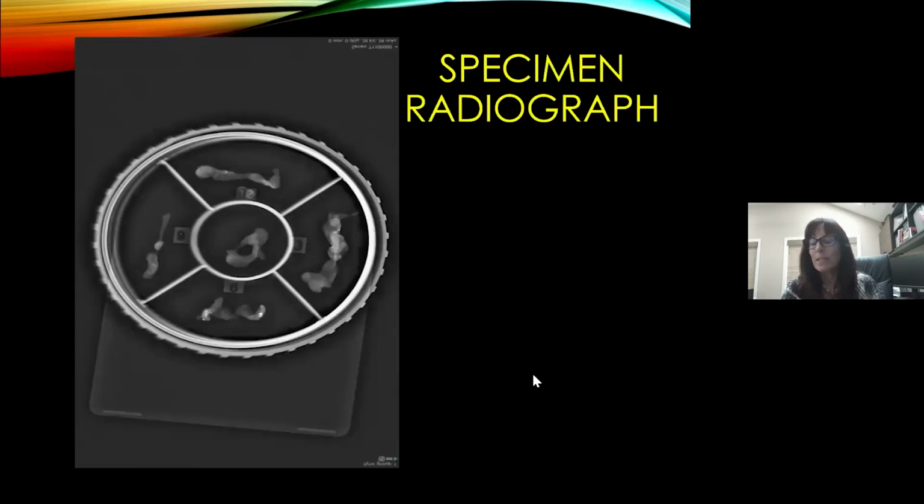And we opted not to get a post-fire image because with tomosynthesis, the needle can obscure the underlying target. Specimen radiograph shows calcifications in several cores. Here's some calcifications here and up here. And the diagnosis was fat necrosis. This was biopsied last week, but the results came back rather quickly.